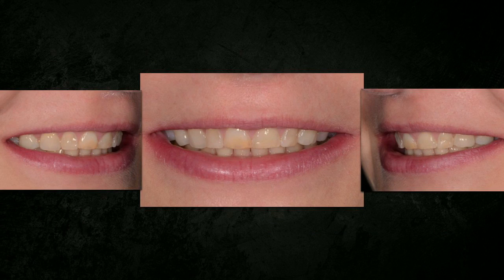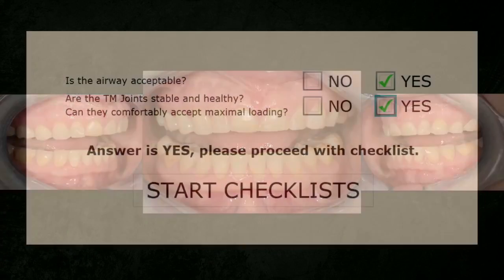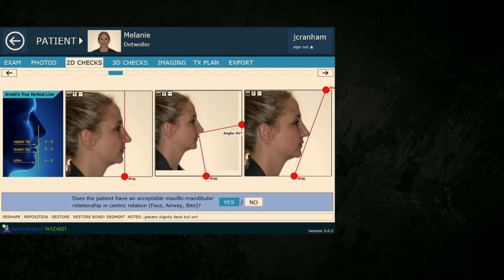As we look at her teeth, they're definitely short, they're definitely back. And wear and erosion on both sides. Thankfully, her joints are healthy and her airway is good.